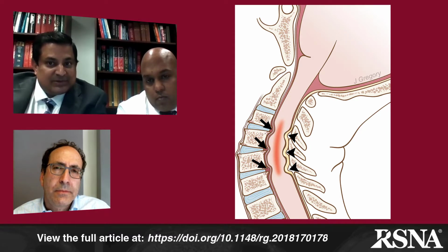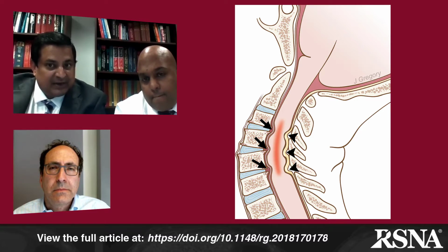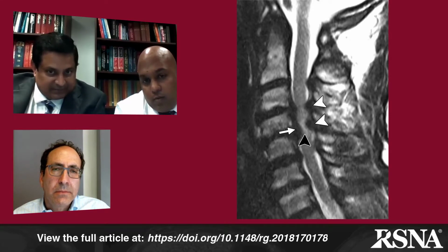Figure 13 shows hyperextension injury in older patients with central cord syndrome due to underlying cervical spondylosis. Arrows point to anterior disc osteophyte complexes, and the arrowheads point to posterior buckling ligamentum flavum. See the pinching of spinal cord between anterior disc osteophyte complexes and the posterior ligamentum flavum buckling, and see the central contusion in the center of the cord. Figure 14 is a classic example of the above graphic.